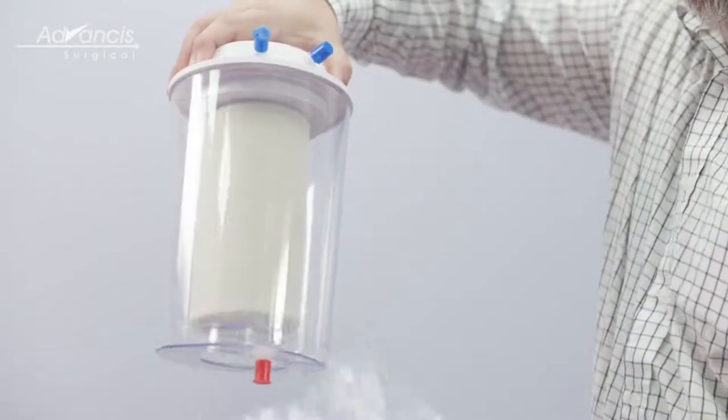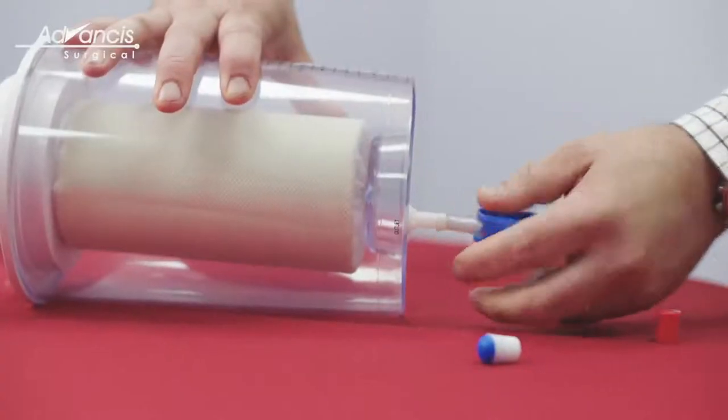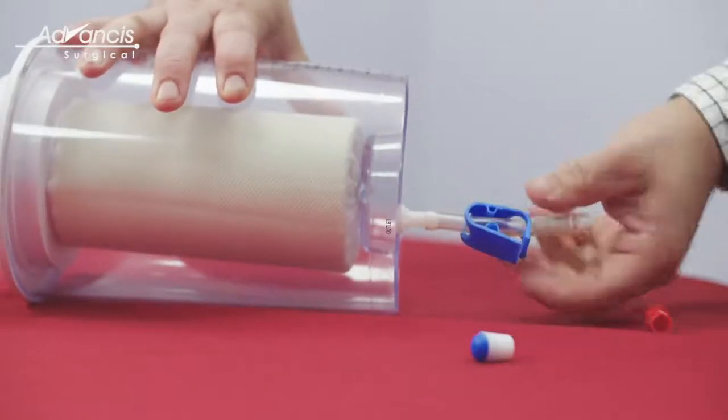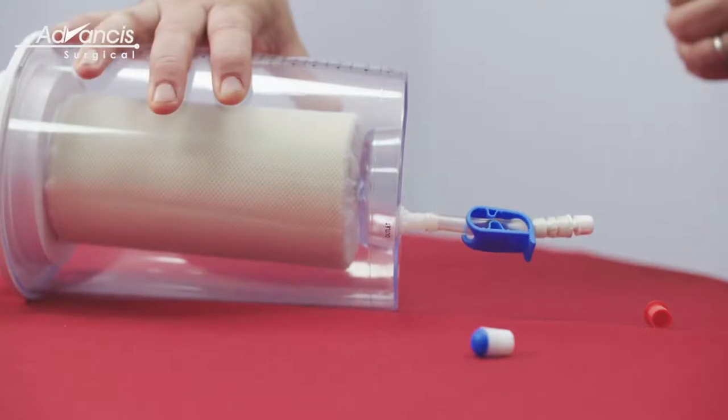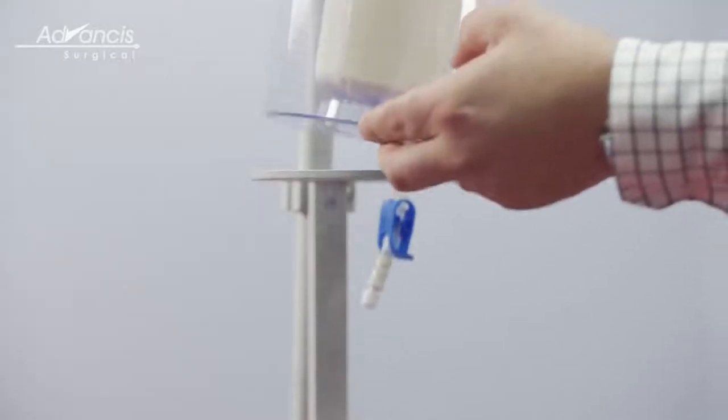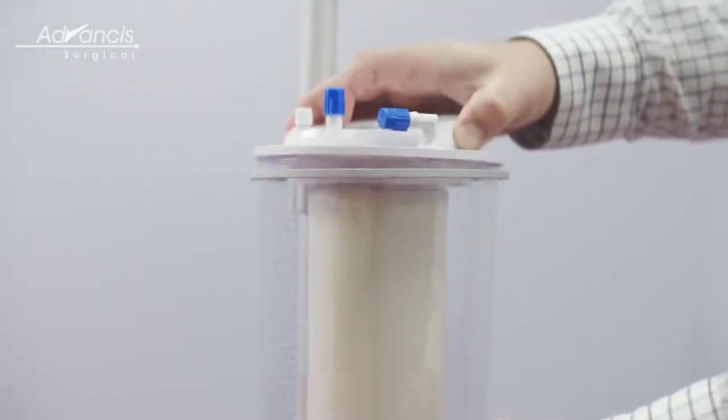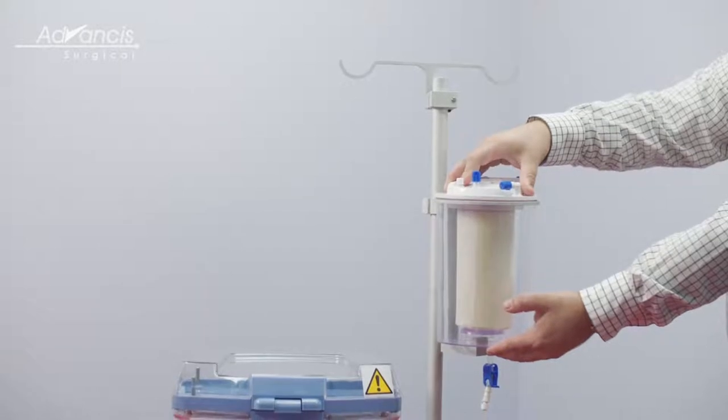Open the Hemosep Collection Reservoir packaging and place the small tube into the outlet at the bottom. Ensure that the clamp is closed and the tube is seated securely. Place the Hemosep Collection Reservoir into the holder on the Hemosep Shaker unit.